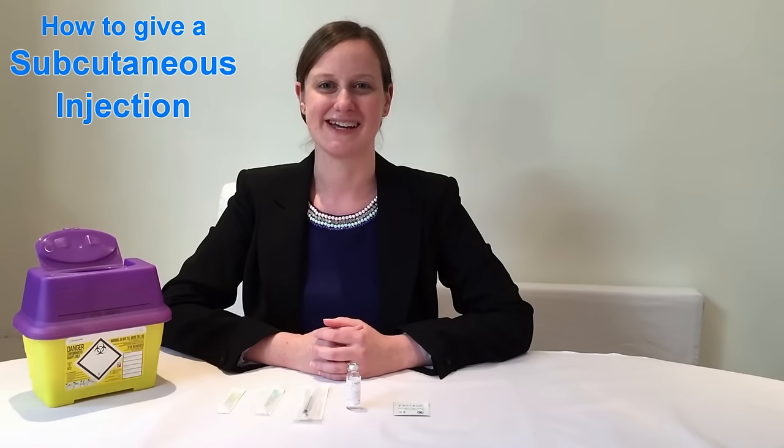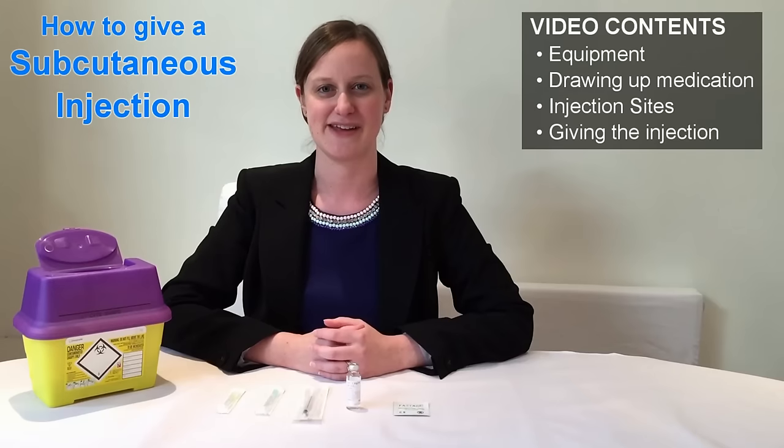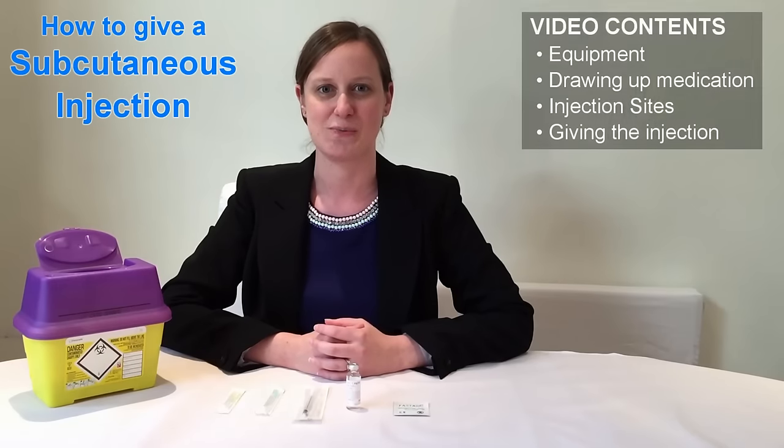Hello, my name is Miranda and I'm a doctor. Today I'm going to be showing you how to draw up and give a subcutaneous injection. I'm going to show you and talk you through the process in easy, simple steps so that you feel confident with the whole procedure.